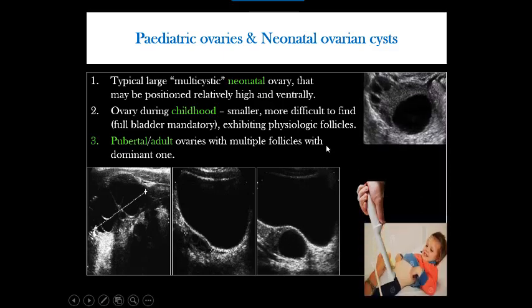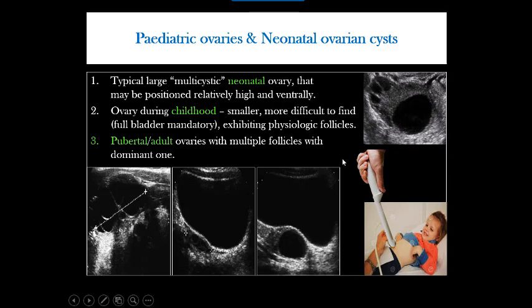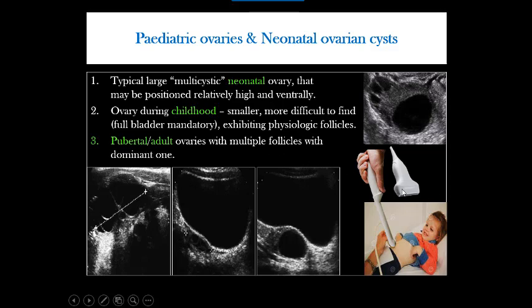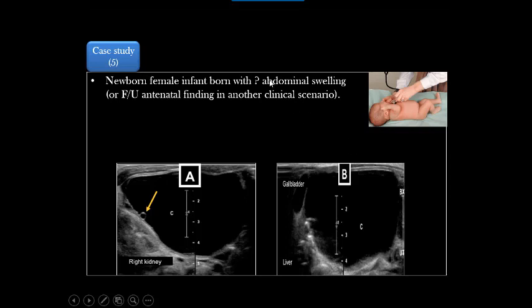During childhood the ovary is difficult to detect using a convex probe. It is much easier using a higher frequency, higher resolution probe — a trans-vaginal probe through the abdominal wall, or better, a linear probe through the abdomen. When using a linear probe, the reverse applies: empty the urinary bladder, especially in cases of suspected ovarian lesions, ovarian torsion, or ovarian mass. The ovary will be closer to the anterior abdominal wall and more easily characterized by the higher resolution probe.